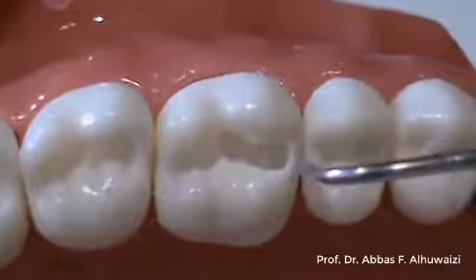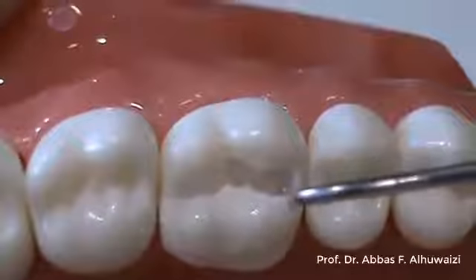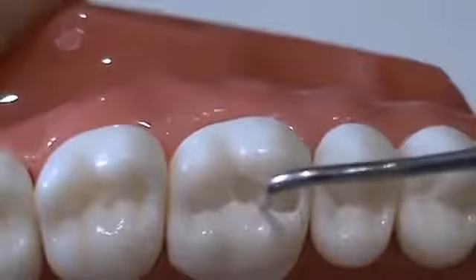The depth of the cavity should remain the same as with the Class 1 cavity.